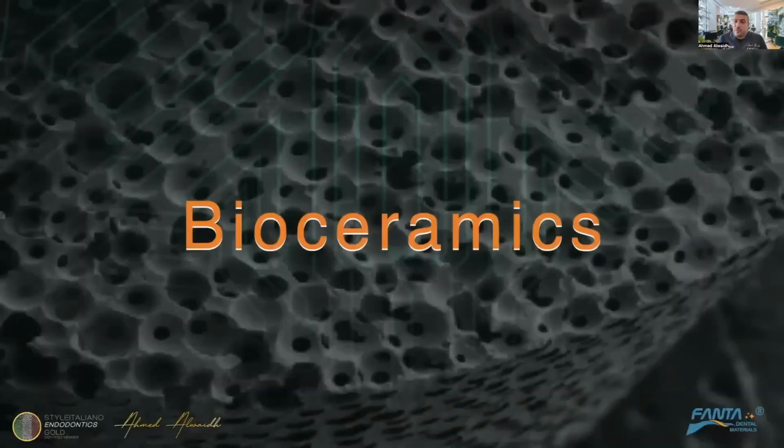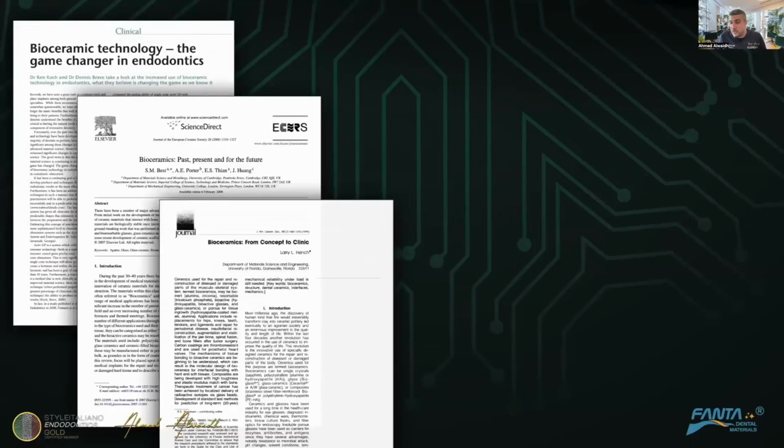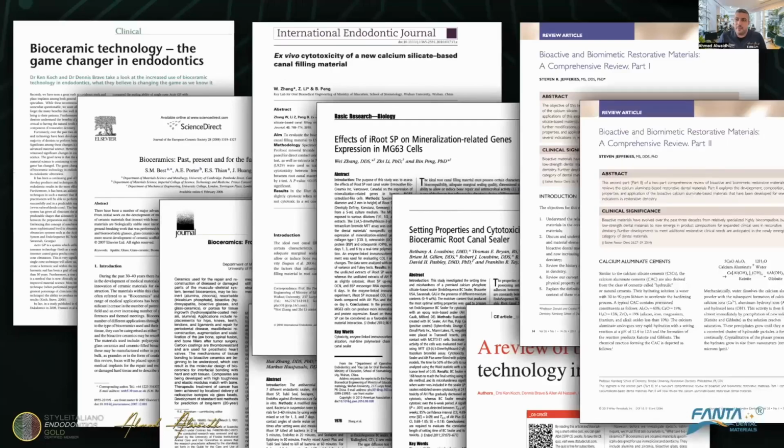But now you may ask about bioceramics, because the majority are using bioceramics. And I'll be honest with you, I'm one of them. I like bioceramics, and in most of my cases, the majority of my cases for the last 4 years, I'm using bioceramics. And there is no doubt that what's called a bioceramic sealer is a false name. It's not a true name, because bioceramic is not a sealer, it's a filling material. So it should be called a hydraulic or premixed hydraulic bioceramic cement. It's hydraulic bioceramic cement. It's not a sealer.